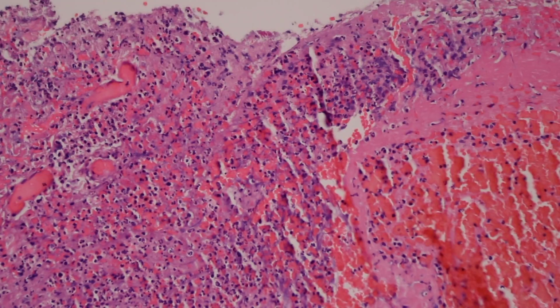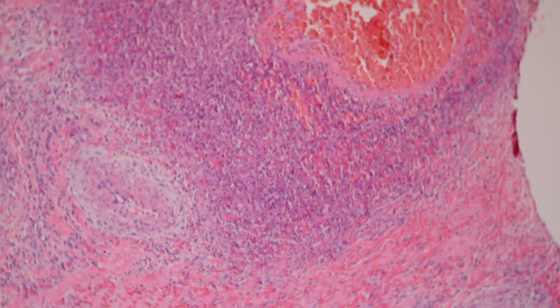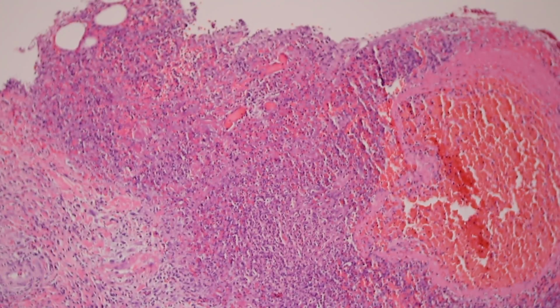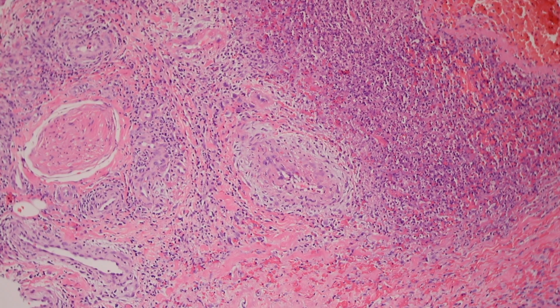And then look out around here, tons and tons of neutrophils, which have basically replaced and totally damaged the vessel wall. And there's also a lot of reactive change in the adjacent smaller vessels. They've got a lot of fibrosis and edema around them, and thickening of their vessel walls, so they're damaged as well and reacting to all this inflammation.